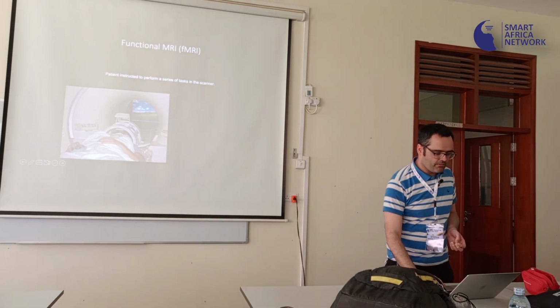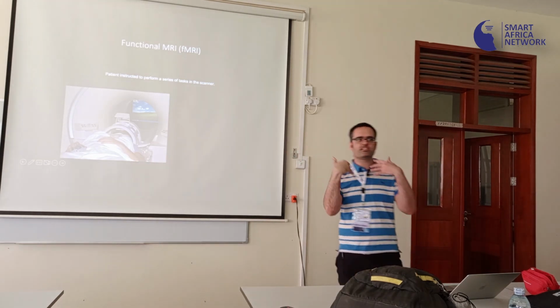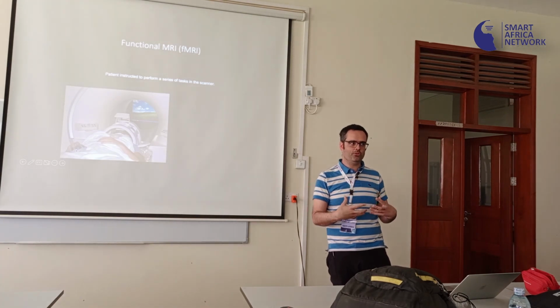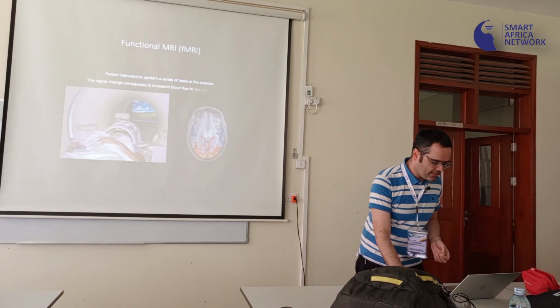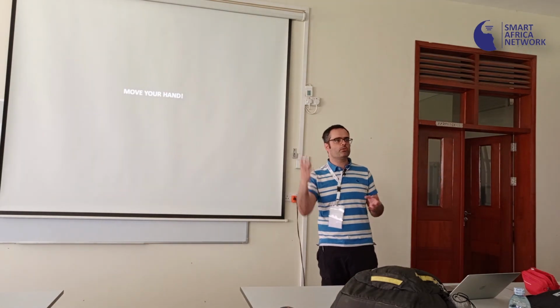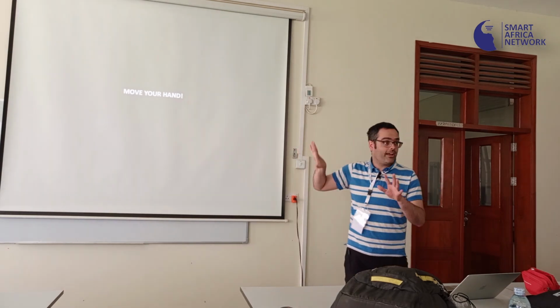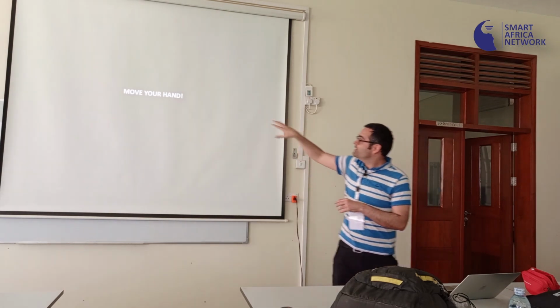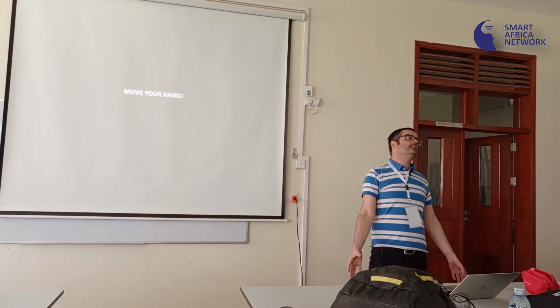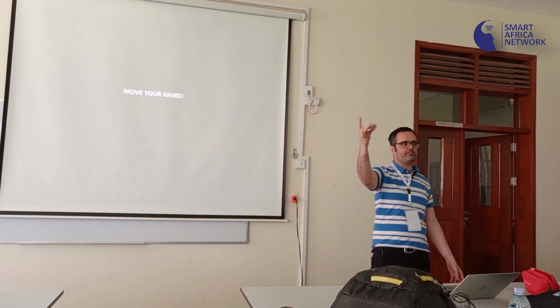And we also usually give them a button to push so that they can give us feedback, so that we know that they're actually following the instructions. A good example of it is what we call a tapping task, a motor task. We ask them, you're lying in the scanner, it's dark, and you see instructions in the scanner that say move your hand. And you're lying there and you move your hand in a very specific way.